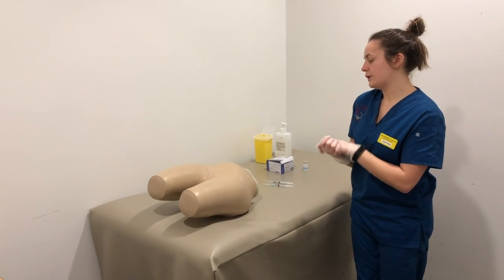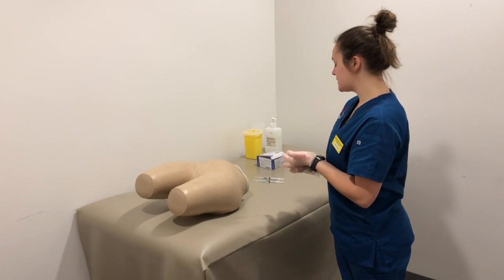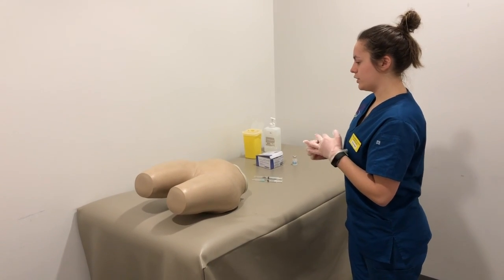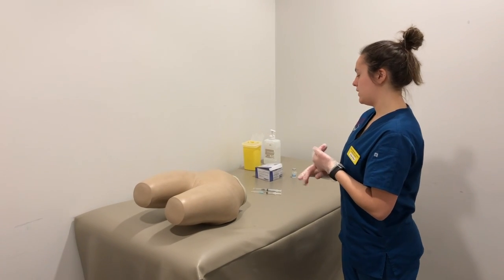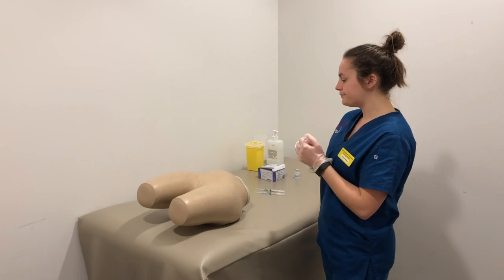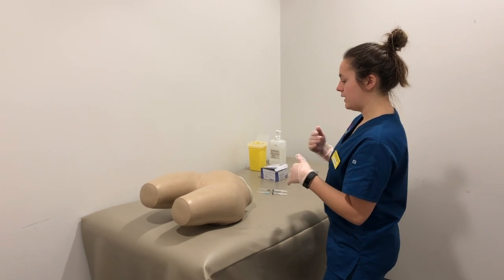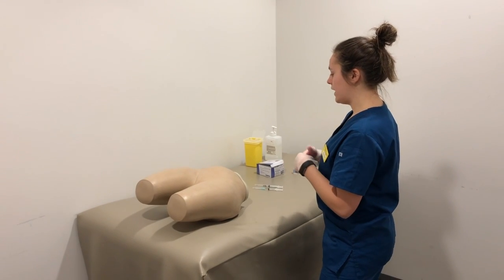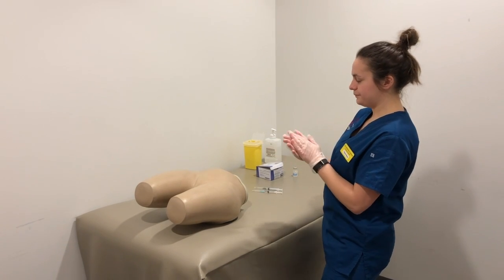I just am here to let you know that I'm going to be giving you your medication today. I have your two injections. One is your heparin, your anticoagulant, which is given subcutaneously, and your other one is your Haldol, which is your antipsychotic medication, and that will be given intramuscularly. You might feel a slight prick when we put the needle in, and if you feel any pain or anything like that, let me know, and if you have any questions, you can also let me know, all right?